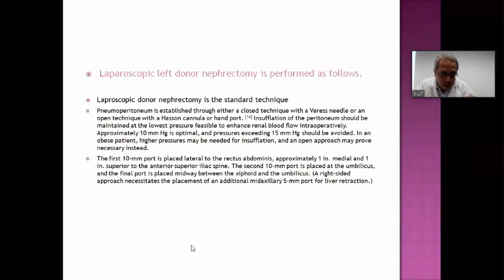those smaller points which earlier were under pressure because of high pressure of gas were actually now coming up, meaning to say they will again bleed, and this is a secondary bleeding, and this is always something which we cannot see. And since we cannot see, this is special to this kind of surgery.